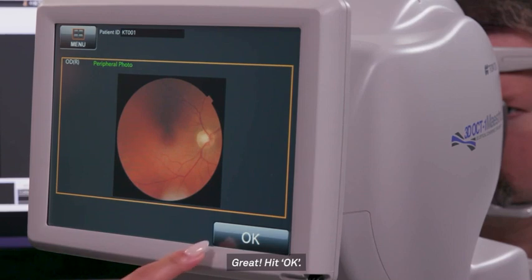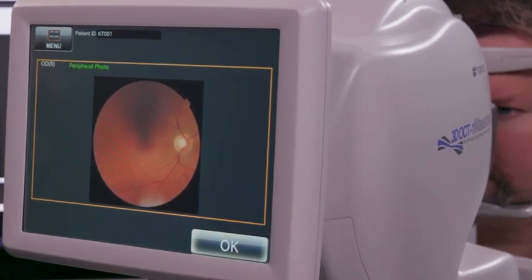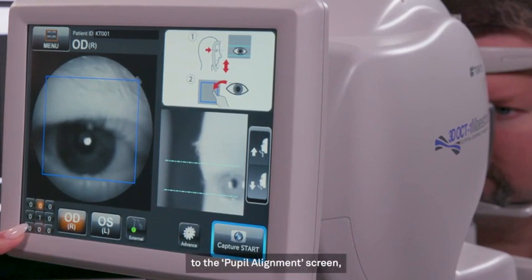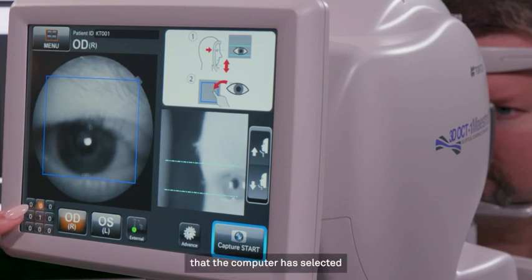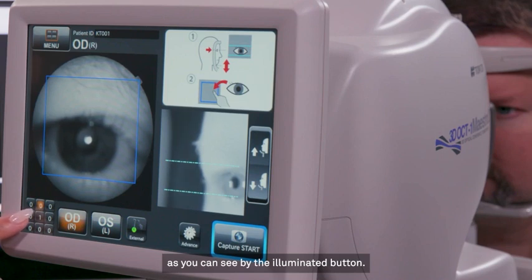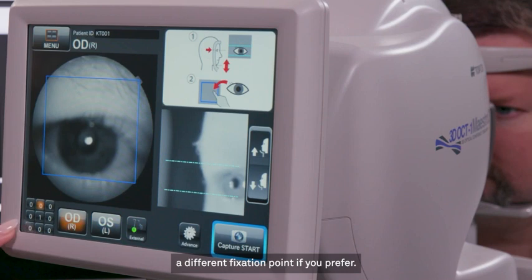Great! Hit OK. Now you'll go back to the pupil alignment screen and you'll see a 1 where you just took the photo. You'll also see that the computer has selected the next fixation point for you, as you can see by the illuminated button. However, you can manually choose a different fixation point if you prefer.